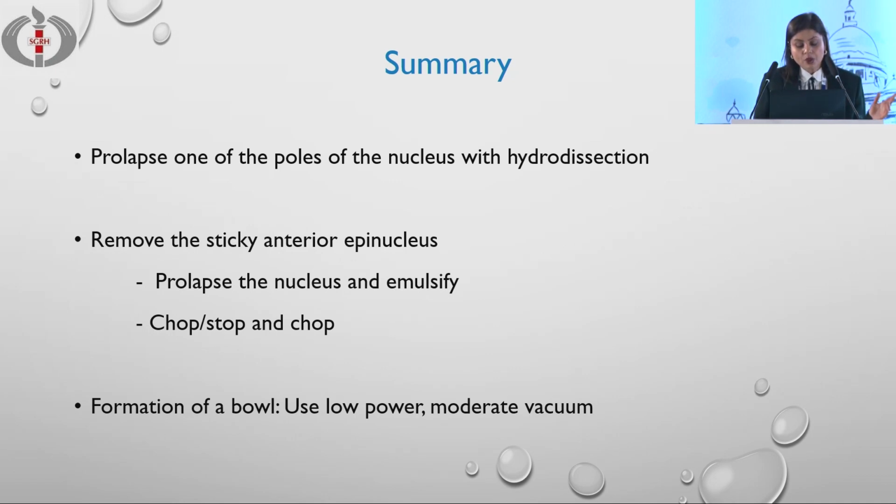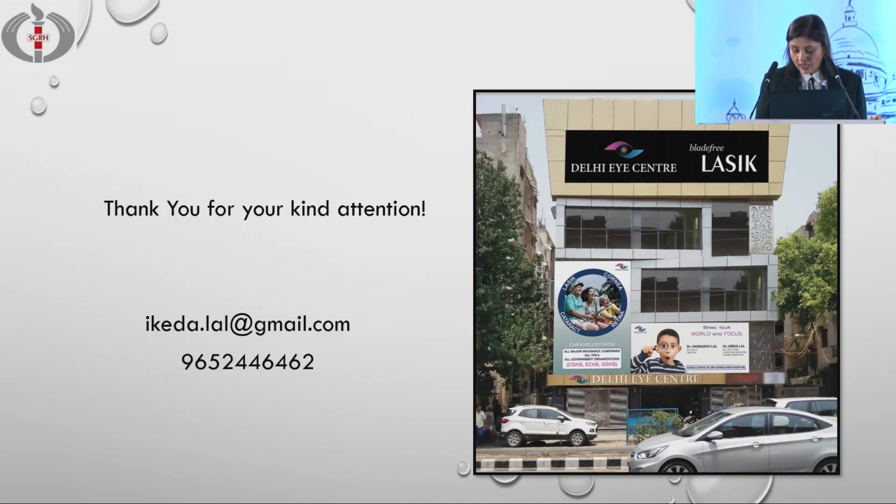And if we have a formation of a bowl, use lower power, reduce the phaco energy setting that we are using, and use a moderate amount of vacuum to go ahead with the procedure. Thank you.